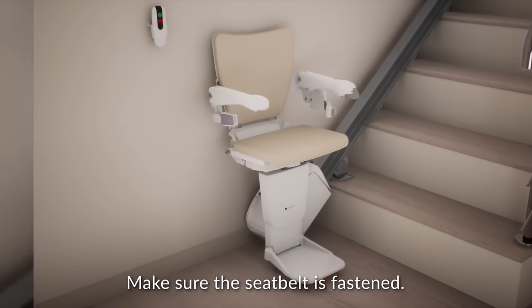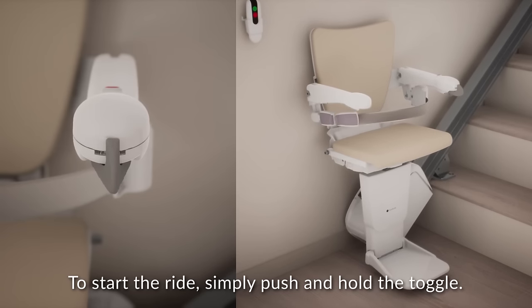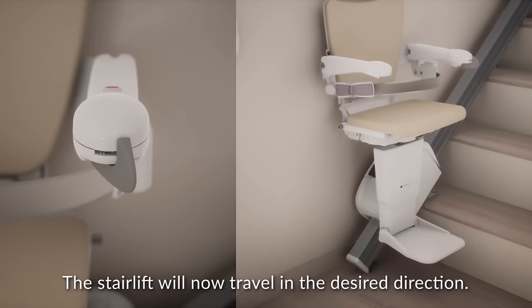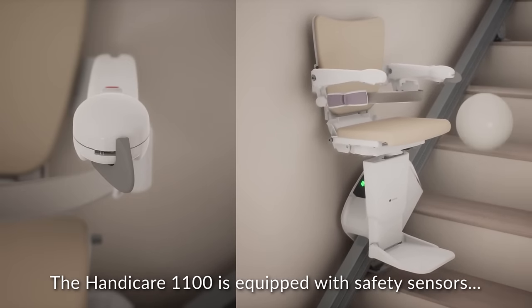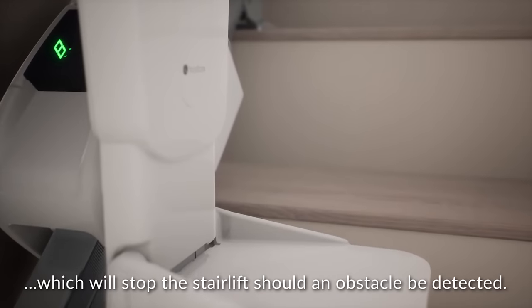Make sure the seatbelt is fastened. To start the ride, simply push and hold the toggle. The stairlift will now travel in the desired direction. The HandyCare 1100 is equipped with safety sensors, which will stop the stairlift should an obstacle be detected.